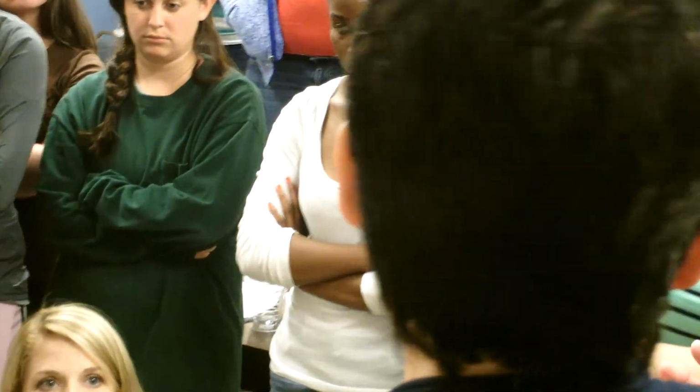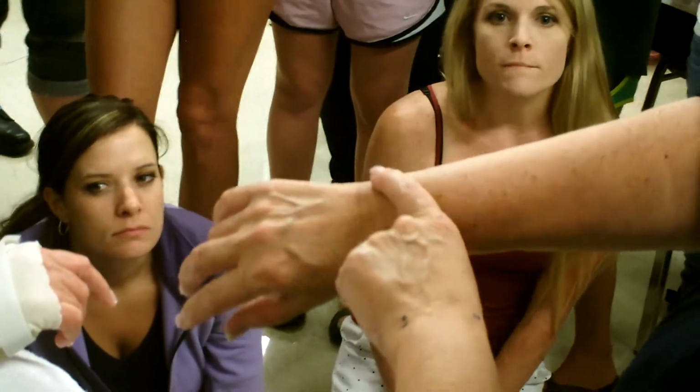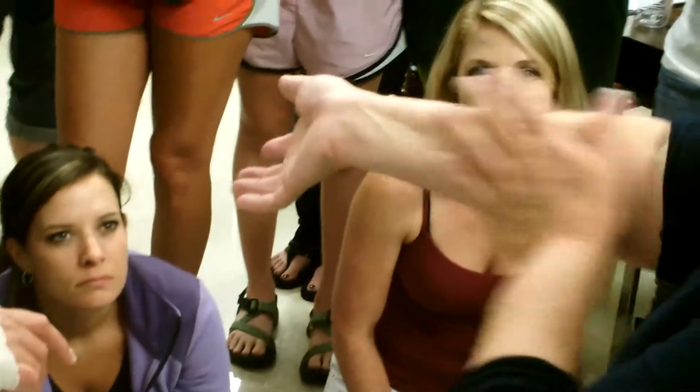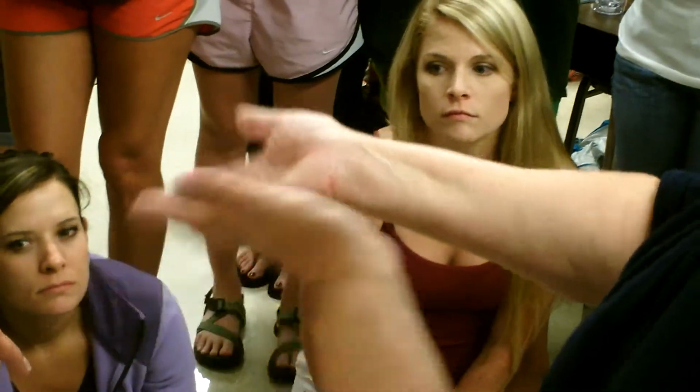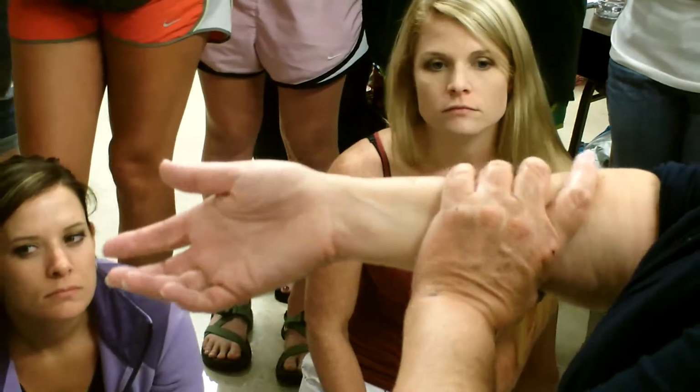I'm going to say whatever the doctor's protocol is. Typically, when a person first gets a splint, you're not going to make them wear it more than 2 to 4 hours at a hit. Say, wear it today for 2 hours, and then take it off, and these are the kind of areas where you might get red areas, okay? So over the bony prominences, sometimes under the strap, if you have too much tension on it.